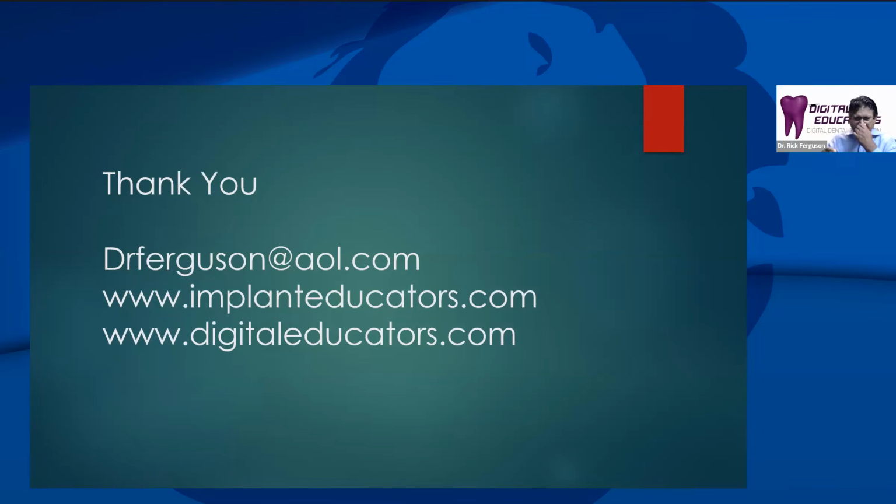Even so, those cell phone cameras now will typically have multiple cameras in them. They're closer together, and you need that triangulation to get the dimensional accuracy to match up with the face. How important that is, I don't know. I know for orthodontic uses you guys are exploring those types of techniques, but I honestly don't have an answer for you as far as how accurate those are. Maybe in the future we'll look at some of those.